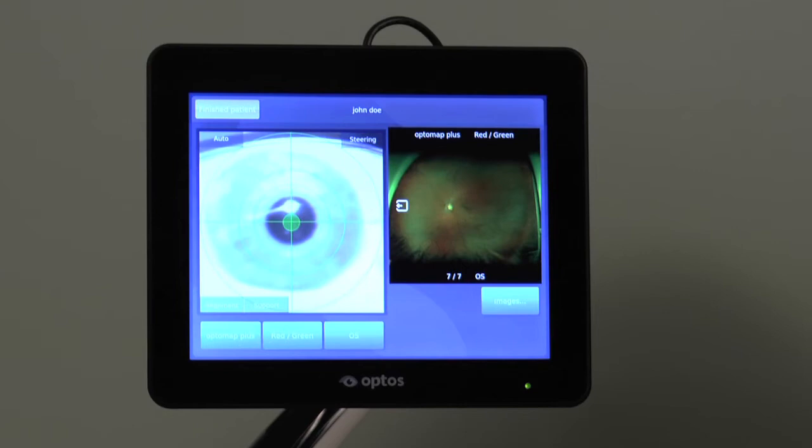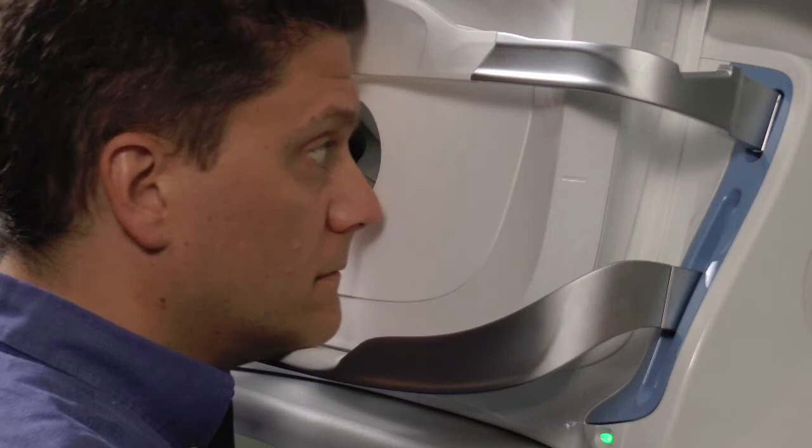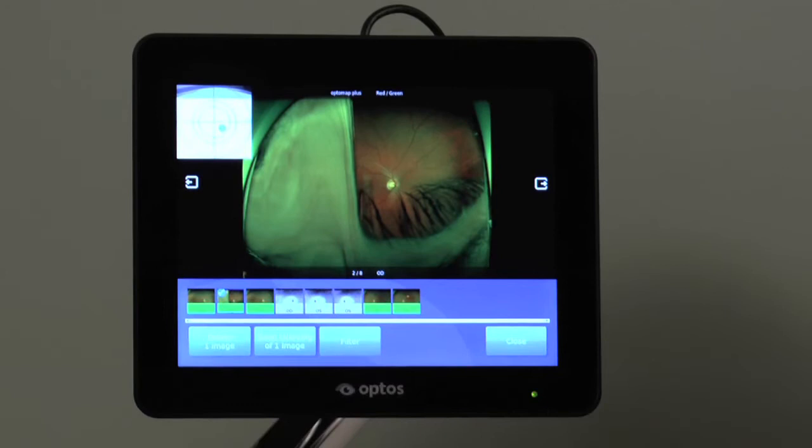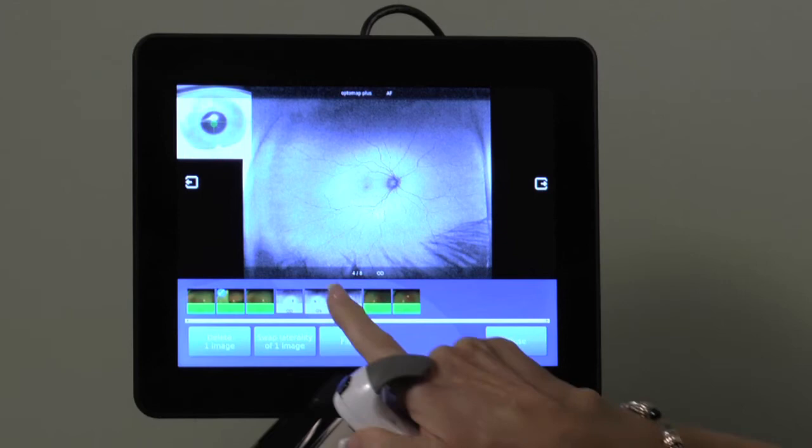Once the session is complete, the patient can sit back and you may press the images tab, which will allow for a review of all captured images. Touching any thumbnail once will open that image in the larger viewing window. Touching the thumbnail a second time will select that image for editing, as indicated by a check mark.